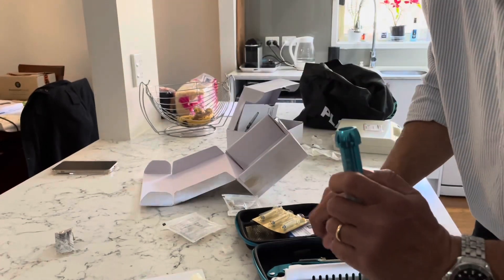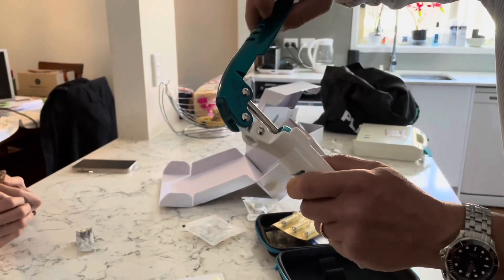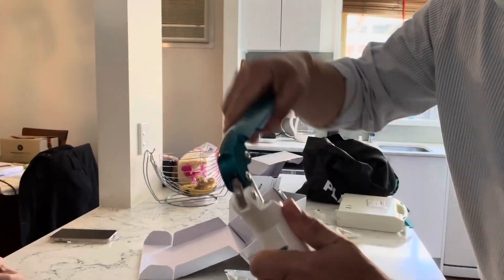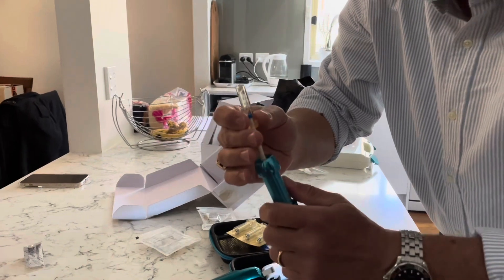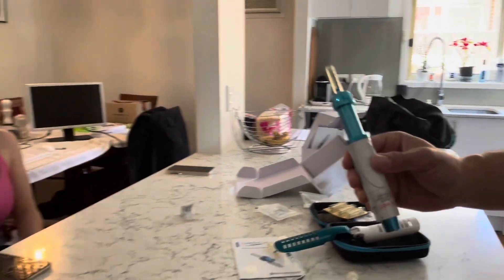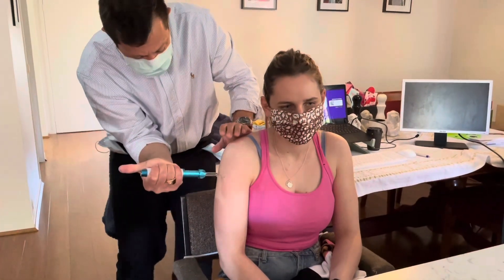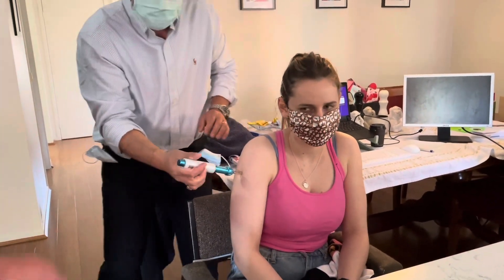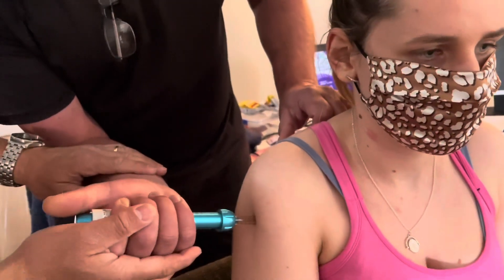Do you feel all good? You felt nothing, right? We've just charged the device. I'm going to take this sterile filled nozzle, and now Doug, you're going to inject your daughter the same way she injected you — using your thumb. Ready? Position yourself right there.